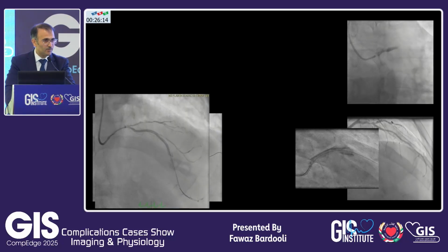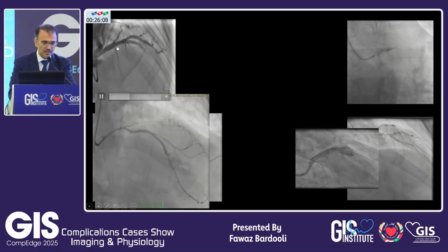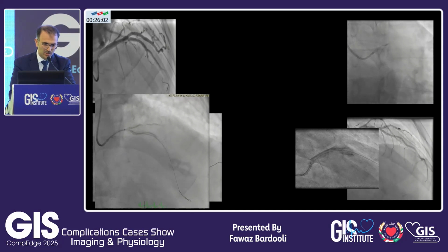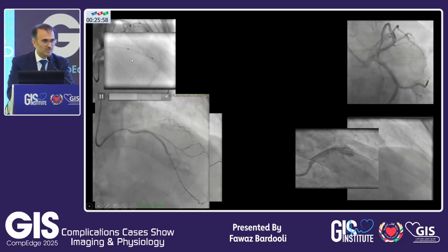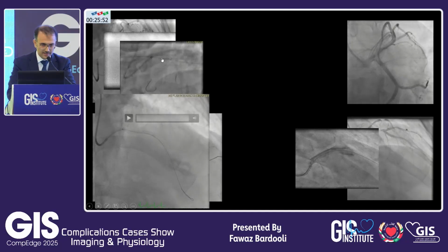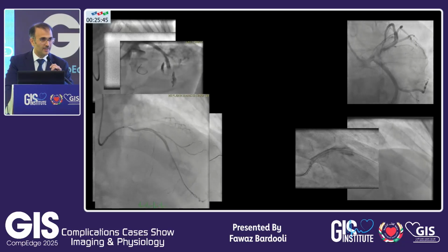Then the primary comes. We manage this. This is the primary. You put the guide, total occluded mid LAD. You wire it. You establish a flow. You feel it's somewhat hazy. It's not expanded very well. You do the IC stent or stent boost. You feel that you need to post-dilate. You take a high pressure balloon and you dilate this, and then you get this. That is not going to be my day, right?